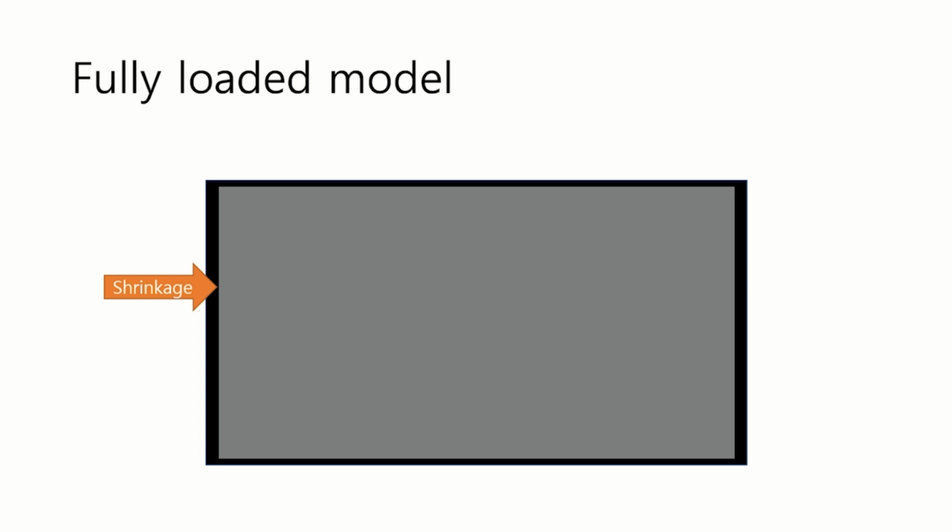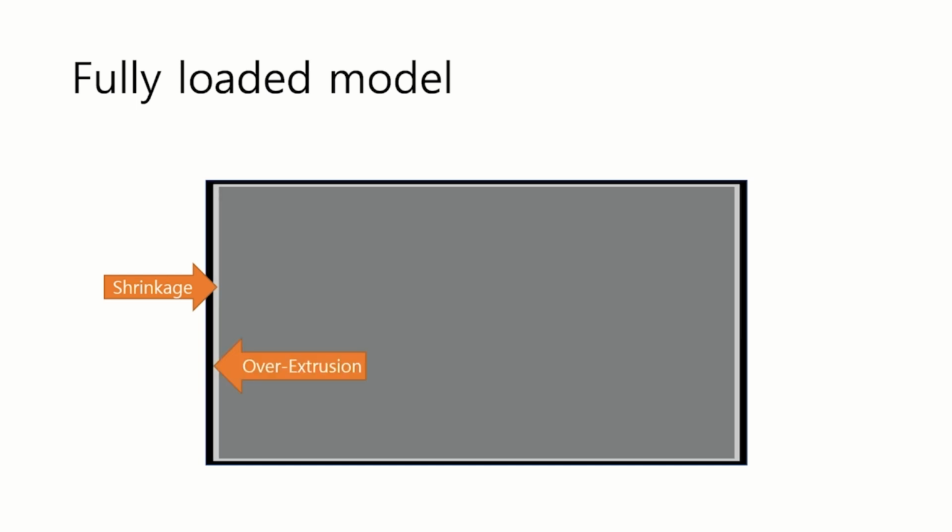In this section, we will address a specific issue that arises when printing black-colored models using 3D printing technology. When printing in black, two simultaneous phenomena occur. The first is the model shrinking and appearing in a dark gray shade, and the second is the outer part of the model becoming thicker and lighter in gray. These opposing effects can mix, leading to an underestimation of the shrinkage values when only considering polymerization shrinkage.